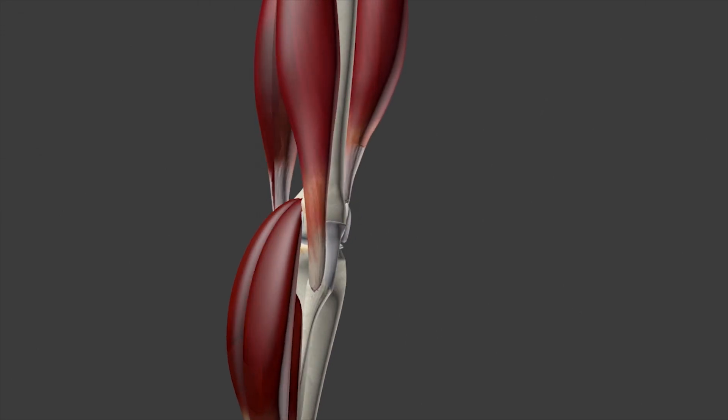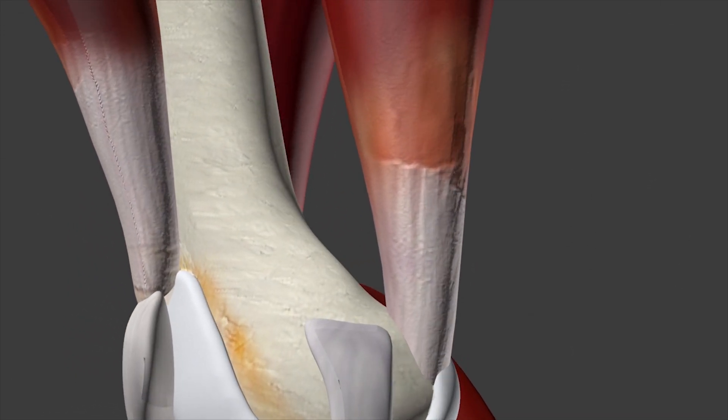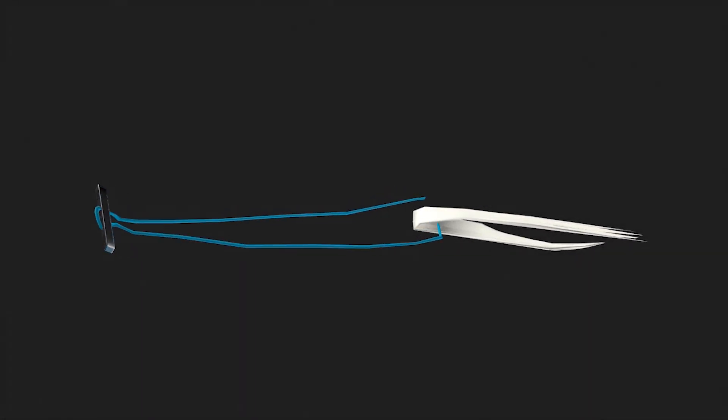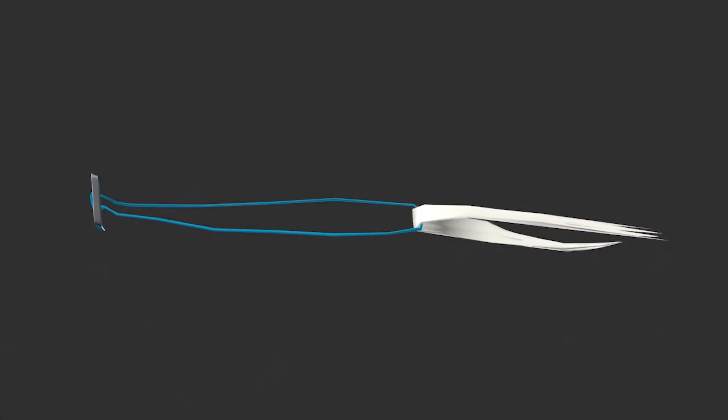In this case, we'll use the gracilis tendon, which is one of the hamstring tendons utilized for ACL surgery. This ligament is folded over to form a two-stranded graft that goes through a small metallic button that will serve as a flip anchor later in the surgery.